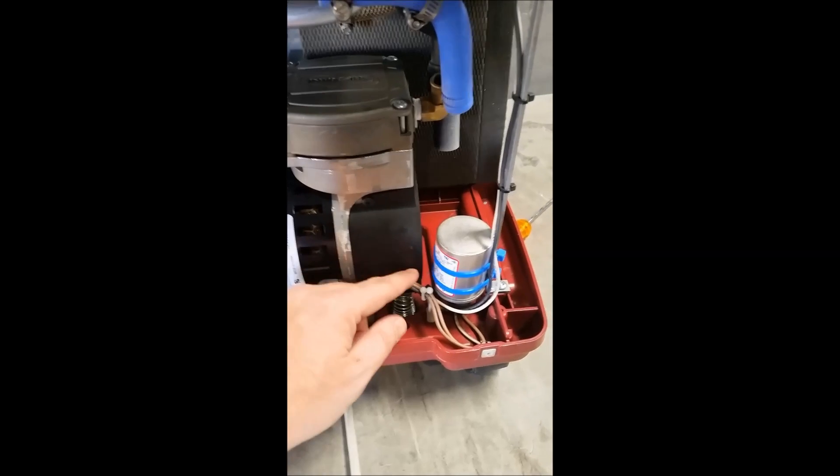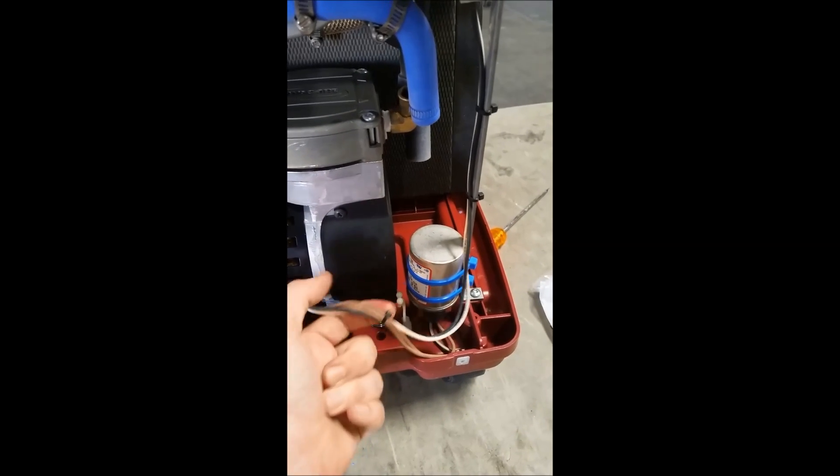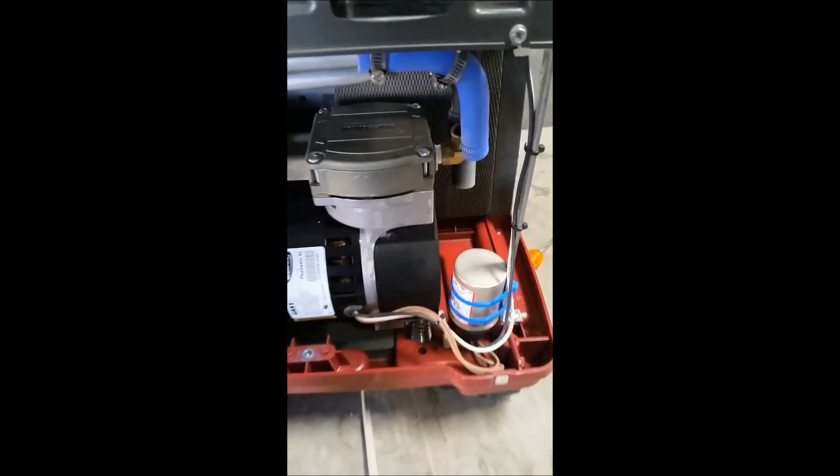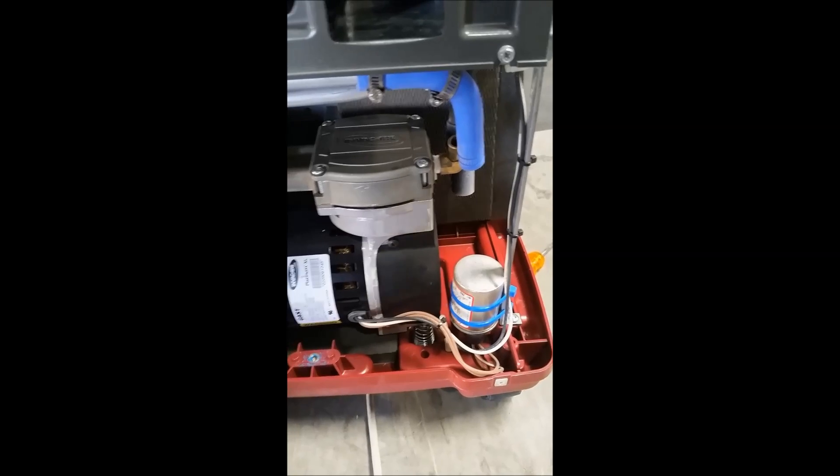Next you'll see that these wires have a small holder here. Simply pull the wires free of the holder — it does snap wide open. Now you're able to pull the concentrator compressor out.